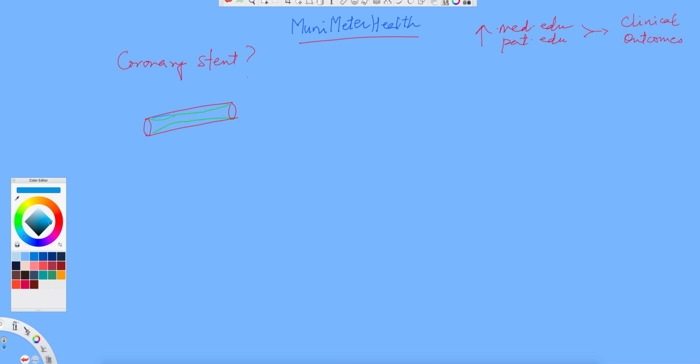Here I am showing a color schematic of where the plaque, stenosis, spasm, obstruction, or a clot is occurring within the coronary, assuming that this is the vessel. A catheter is placed into the artery upstream like this, and the catheter has a balloon at the tip. That balloon is inserted in a deflated condition, and as soon as it arrives at the place where you want the obstruction relieved, the balloon is inflated.